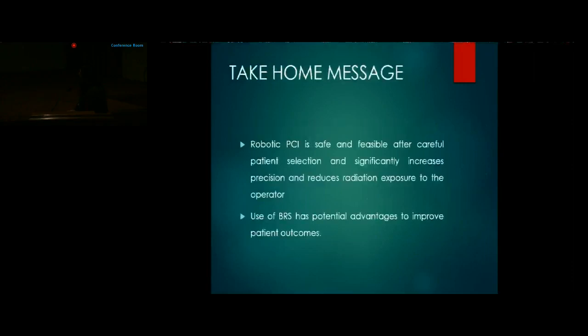So the take-home message is that robotic PCI is safe and feasible after careful patient selection, and significantly increases precision and reduces radiation exposure to the operator. And use of bioresorbable scaffolds has potential advantages to improve patient outcomes in patients such as ours.